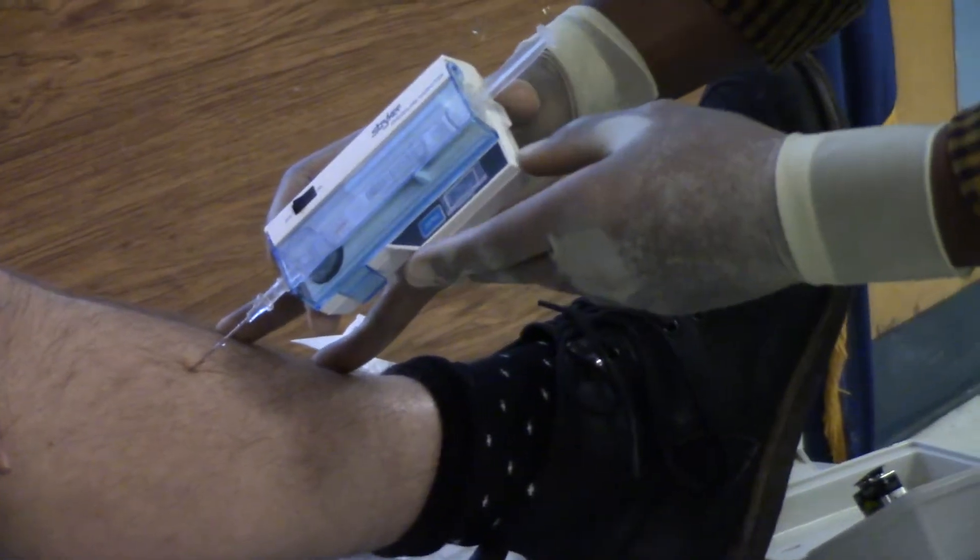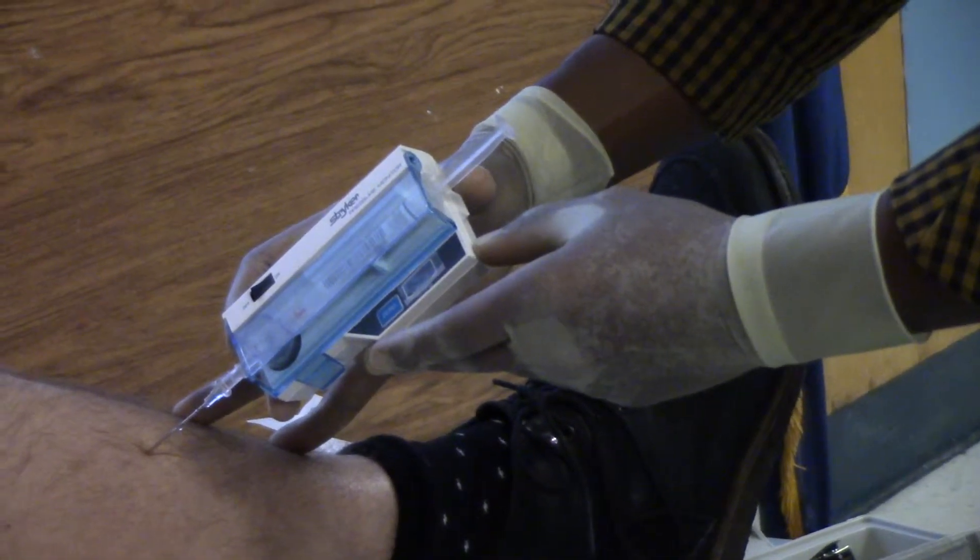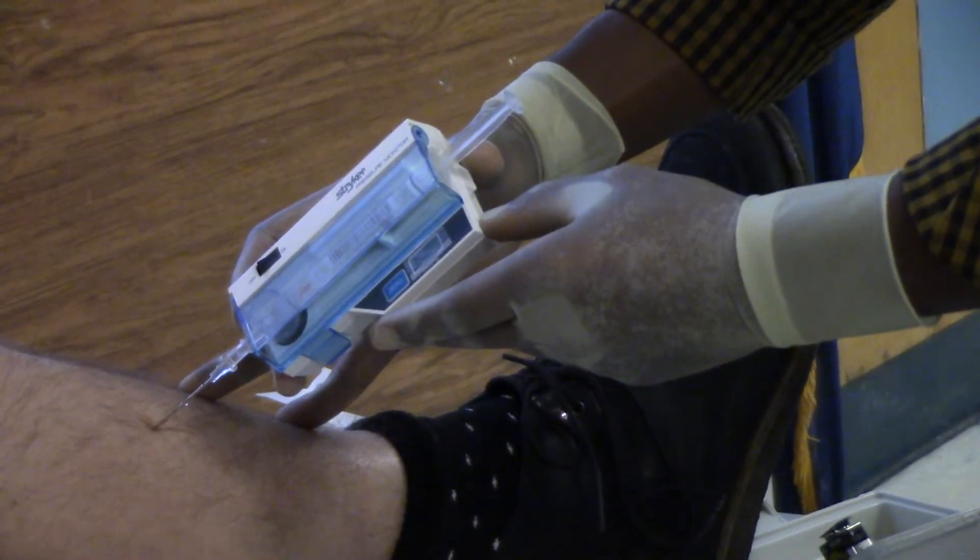14. About 11. 10. All right — 10 or 11. So I don't have to go to the OR today. That's good.